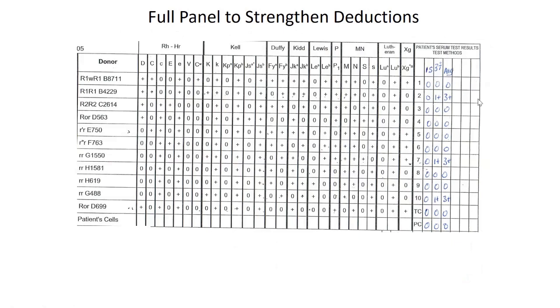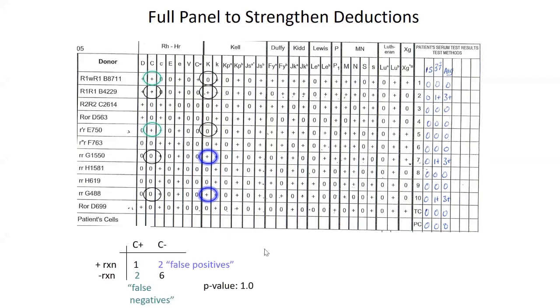In this panel here, we can do our rule outs a lot more effectively. We can also just eyeball what lines up best with the positive reactions. You can see Kel is lining up beautifully, whereas big C isn't at this panel. And in 2x2, you can do this more formally or systematically.